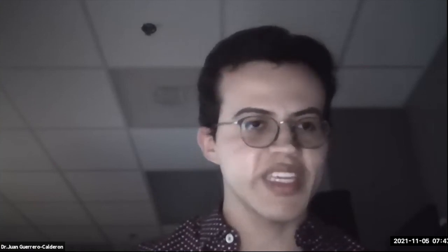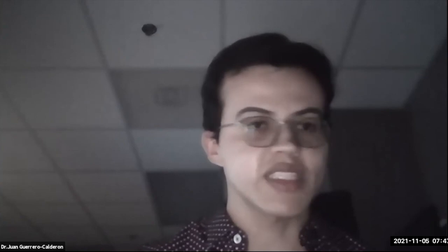And it seems those were all of the questions that we had. It's a very interesting topic that has a lot of potential, and thank you so much, Dr. Zamora, for going over all the technical part and all the ways that it can be implemented in practice. I think it's certainly something that we're going to keep hearing about, and it's going to keep growing. And as you were saying, hopefully at some point we'll see it in BI-RADS too.